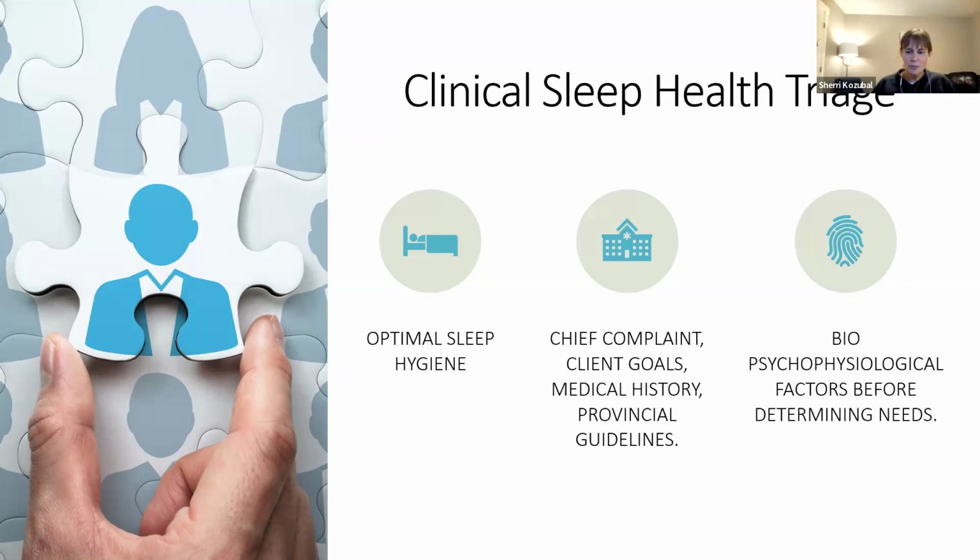Or, you know what, I can't sleep in other places. Or I have family, or I've got something going on. There's always something, and we hear this all the time. And in those cases, the docs can often look at home sleep apnea tests. Now, that works as long as there isn't a comorbid condition or other extra factor. Because if there looks like there's anything outside of sleep apnea, or they are dealing with other major health conditions such as diabetes or metabolic syndromes just in general, which we see quite often with sleep apnea, then we can't do those home sleep tests. So then, because the provincial guidelines are telling us that this person may be complex, we do need that higher level study for a definitive diagnosis.